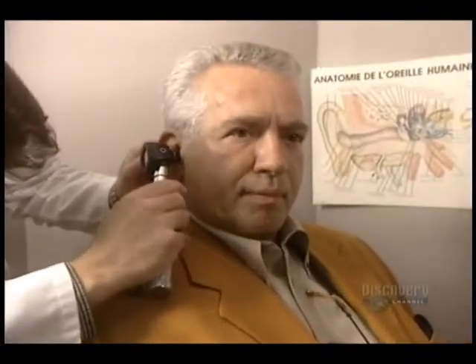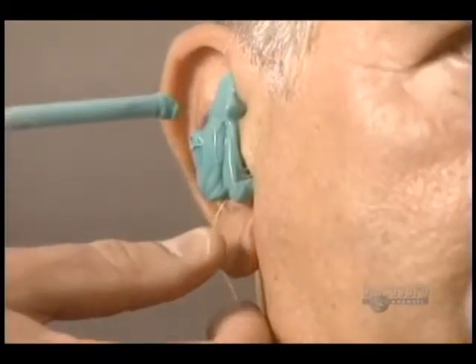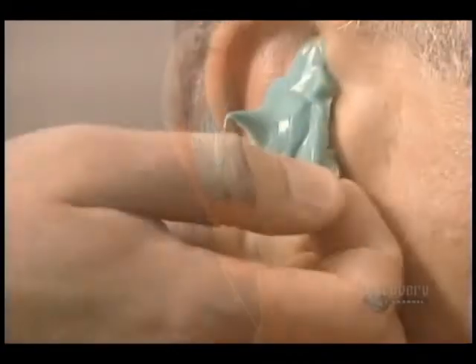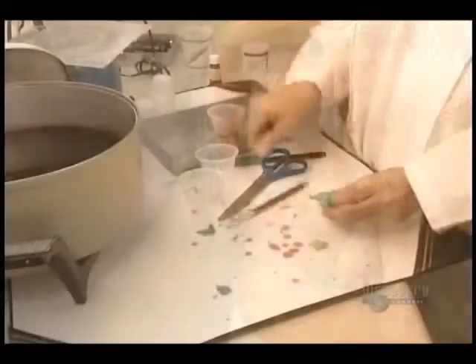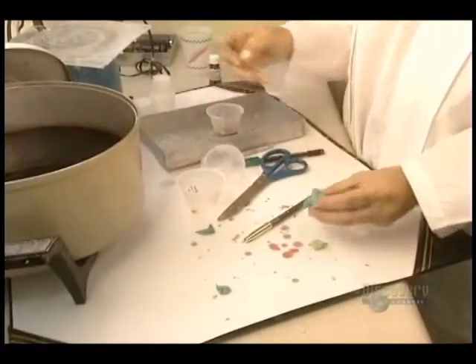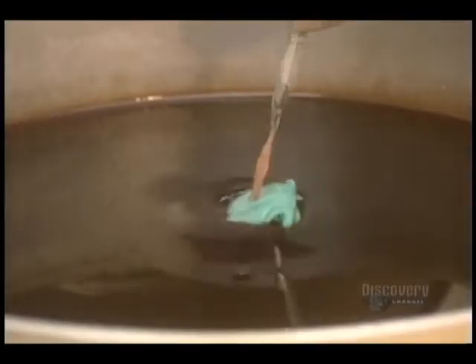So they make a mold of the ear canal. To protect the eardrum, an oto-block is inserted. Next step is to pour in a silicone impression-making material. It solidifies and is then removed from the ear. This congealed mass, representing the ear canal, is then soaked in warm wax to obtain a positive imprint.